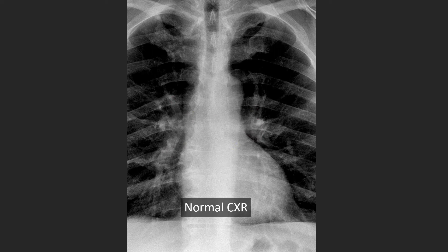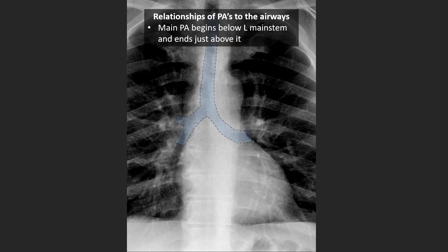The key thing here is the relationship of the arteries to the airways, because we can't really see the arteries that well, but we can usually make out the airways on the chest radiograph. The main pulmonary artery begins just below the left main stem and typically ends a couple centimeters just above it — you can see its relationship to the left main stem airway in this area here.